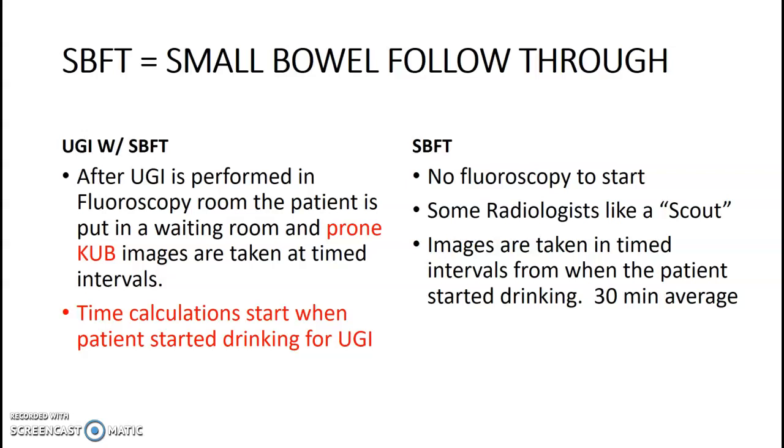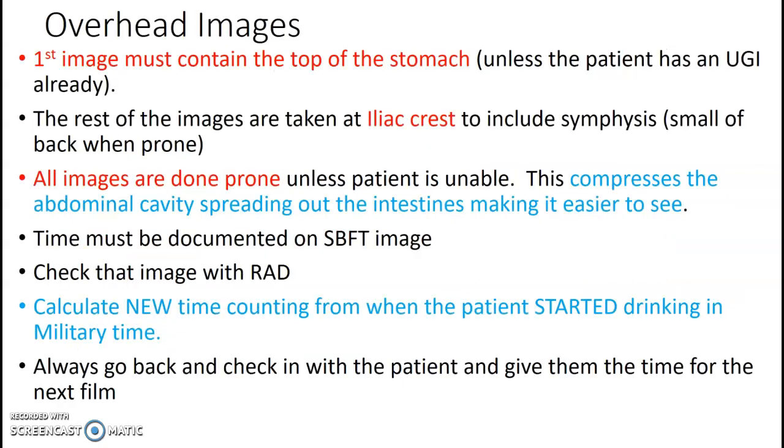If they're doing a small bowel follow-through only, then you are just taking overhead images until they reach their terminal ileum. They don't do fluoroscopy to start, so they have no stomach imaging. Overhead images. All right.